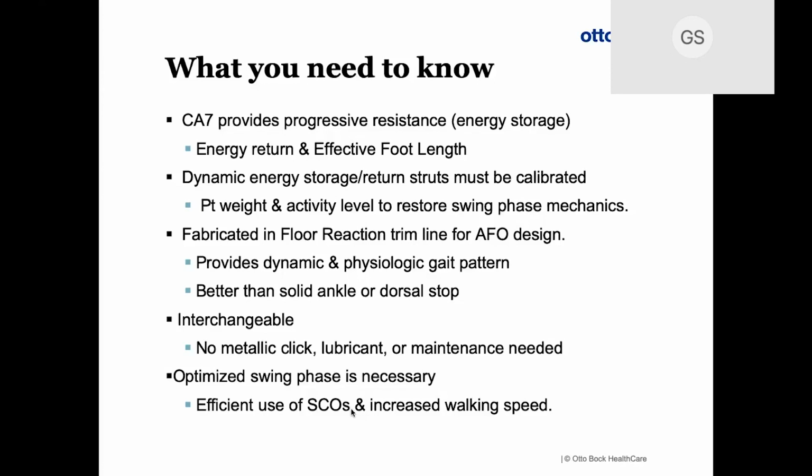And unfortunately, with carbon, we don't want to have catastrophic failure, but this really begins usually with a form of crazing, right, because it begins to delaminate. Carbon's great stuff, but it has to be glued together. If you lose that matrix, then that's when you have problems. So it's really important that you get a very accurate design. So with great power comes great responsibility. You as an orthotist have to do your job even better. So you have to provide this dynamic movement.